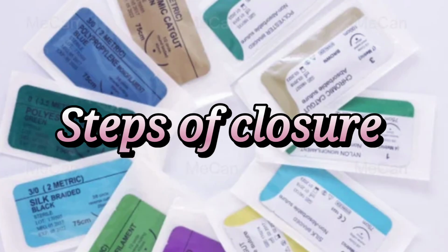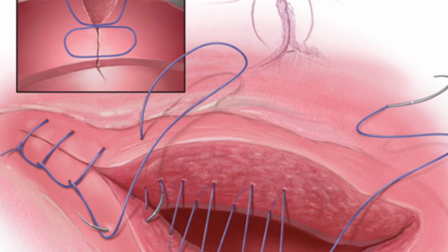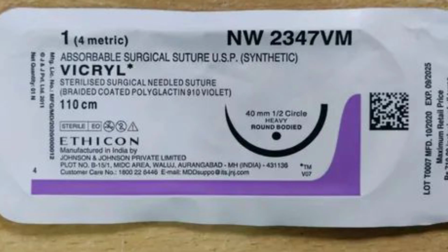Now I am going to tell how they close each incision, what type of instruments they use, and what type of suture material they use. First, they will clean the uterus thoroughly. After that, they catch the margin of the uterus. They will check if any bleeding is coming. How do they catch the margin of the uterus? With the help of Allis forceps. Once it is finished, they start the suturing. What type of suture do they use? They use 1 vicryl or 1-0 vicryl, which is an absorbable suture material.